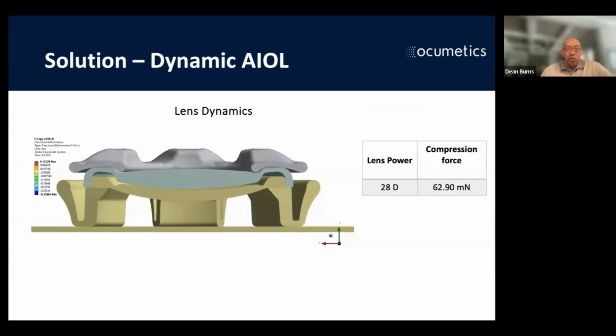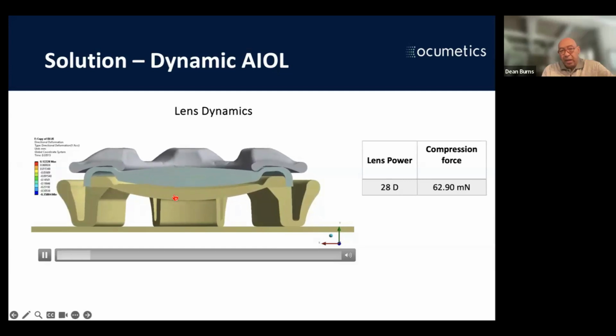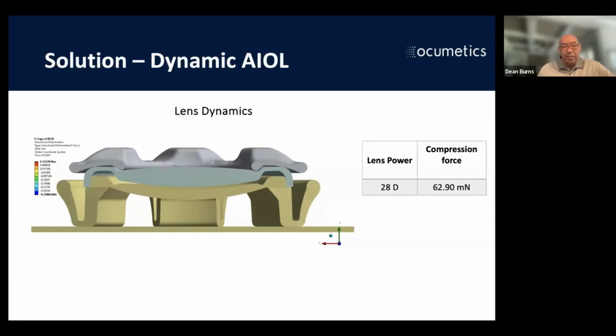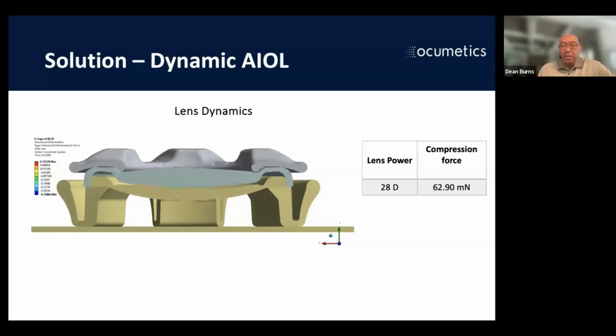So this is a CAD drawing of what that lens looks like, and as you can see, the two come together. This is the black annulus that went in. It's just gray on this CAD drawing. This green optic is the anterior optic, and this gold optic right here is the posterior optic. We can make a variety of lenses, and they are shape changing. In other words, it gives us the ability to naturally see distance, intermediate, and near.